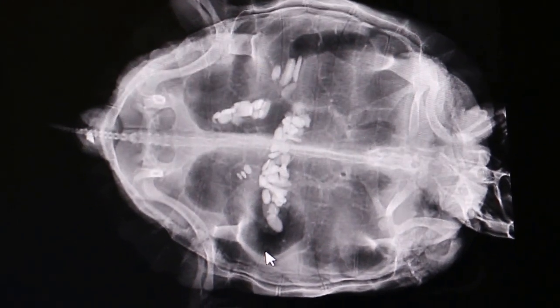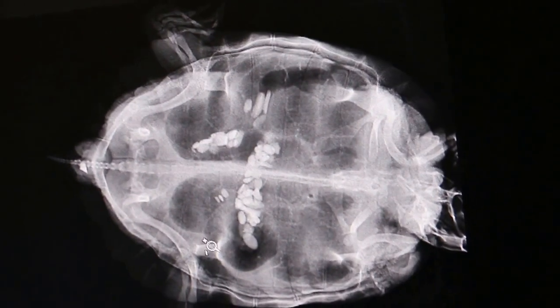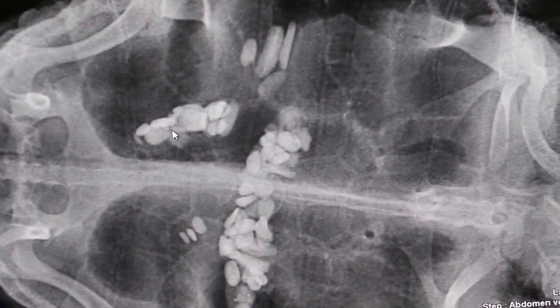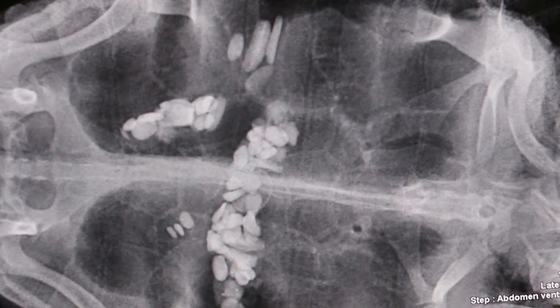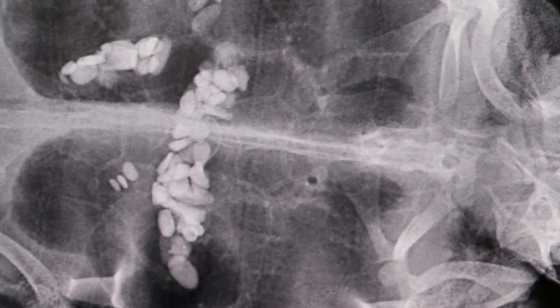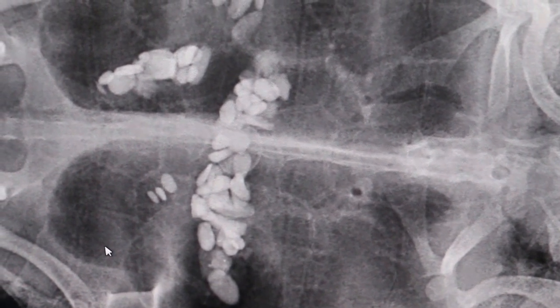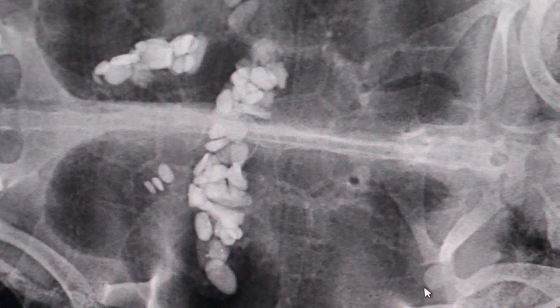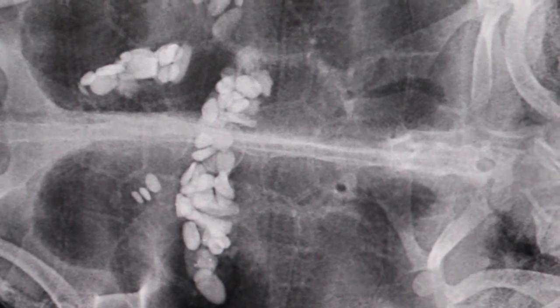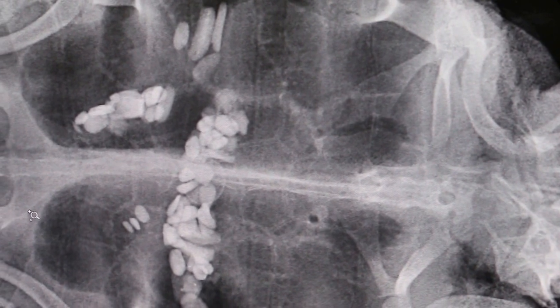Let me see — are these stones or not? Wait, let me see. There are two uteruses normally, so these could be small eggs. Where is the cloaca now? Where is the back side and the front?